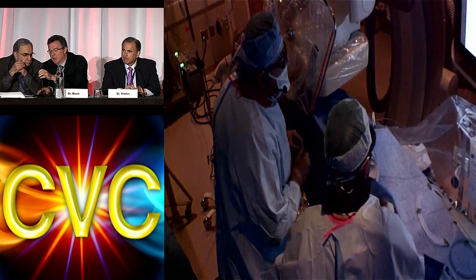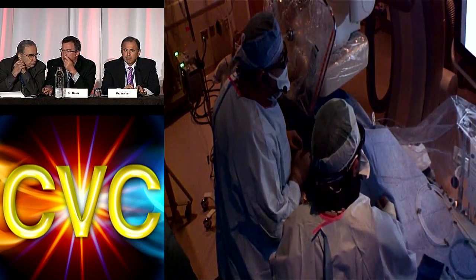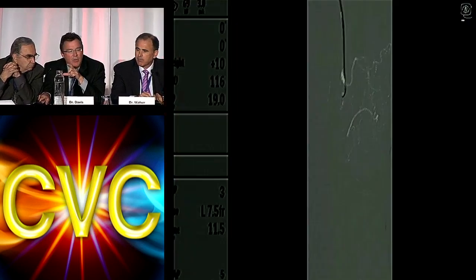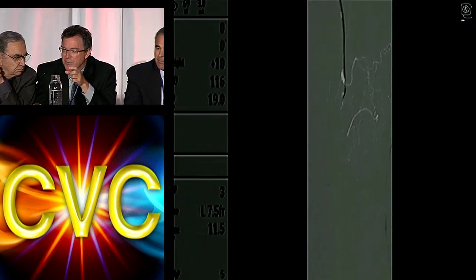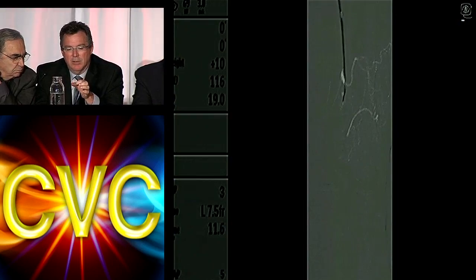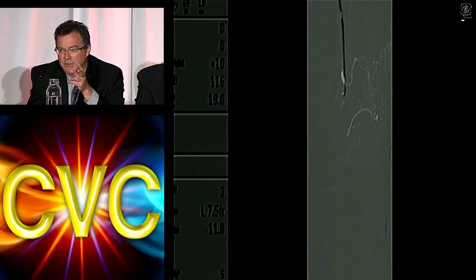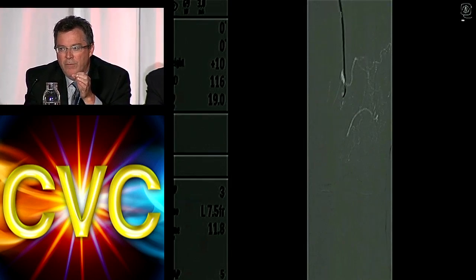Yeah. There's another interesting catheter, and I think it would work for this spot as well. I think it's called Multicross. They made it for the coronaries, but it's a nitinol sleeve, almost like a stent, that can be resheathed. It goes in proximal to the cap, so it gives you a lot of support, but it's got 3 wire ports. You can use your 014, 018 wires in there, and very stiff wires.